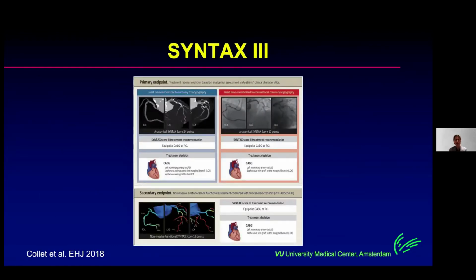An important slide is by Colette from the group of Serruys on the SYNTAX III trial, who compared whether you actually need patients with 3-vessel disease to undergo invasive coronary angiography in conjunction with CT coronary angiography with FFRCT, whereas the heart team decision did not show any difference.